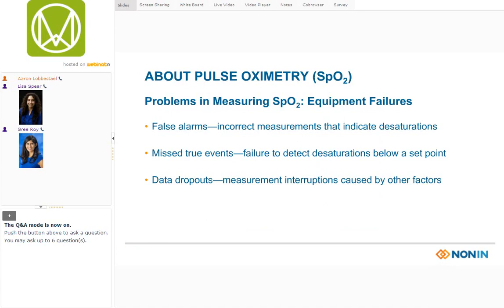By now, you're beginning to see the range of quality among pulse oximeter devices. As more clinicians have adopted SpO2 measurement, manufacturers have rushed products to the market. Instead of keeping medical professionals informed about patient status, hastily developed products can contribute to alarm fatigue or miss critical changes in patient conditions. So how do you reduce the risk of pulse oximetry failures when so many things can go wrong?